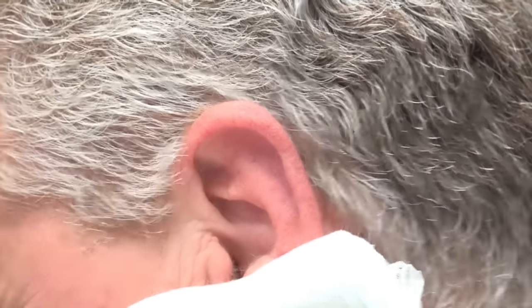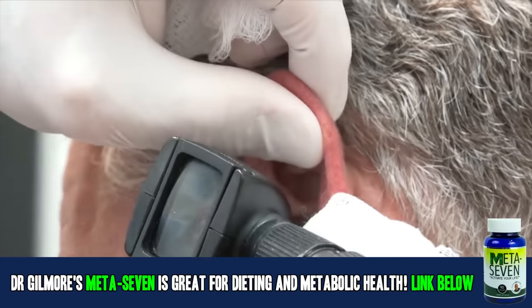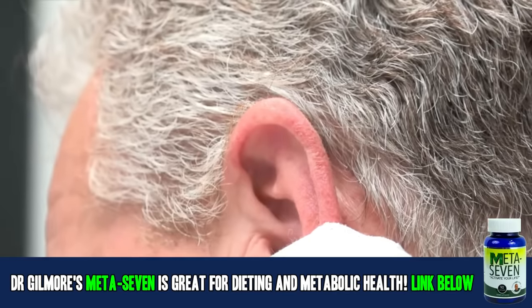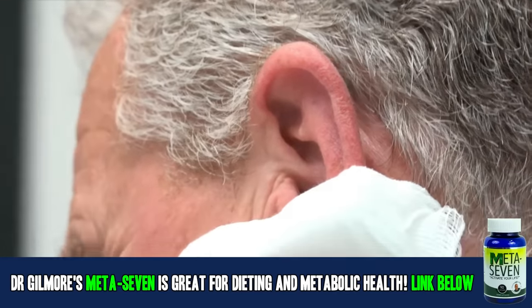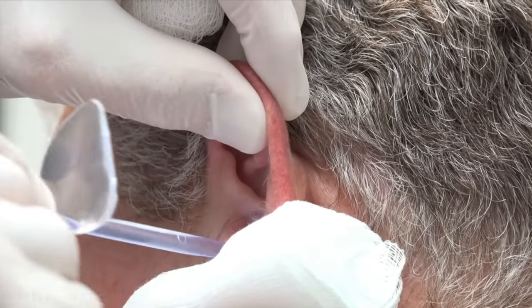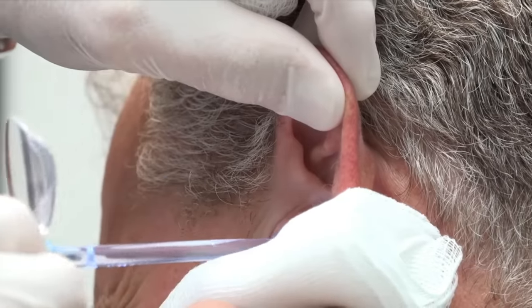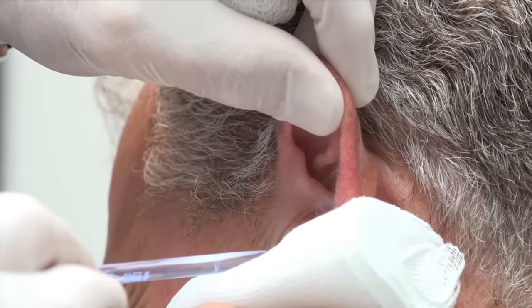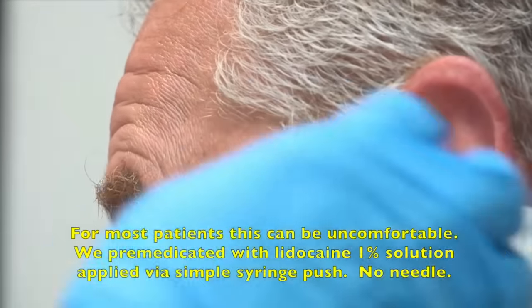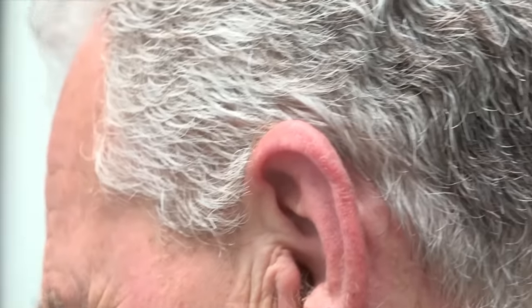Let me take another quick peek in here and see how you're doing. Looks pretty good, but you do still have a bit more — we're going to go back in for some more. Can you feel that? Oh man, it can be a little bit uncomfortable. We just got another big chunk out. Feels like it's hitting my throat — feels like it's going all the way into the throat there.